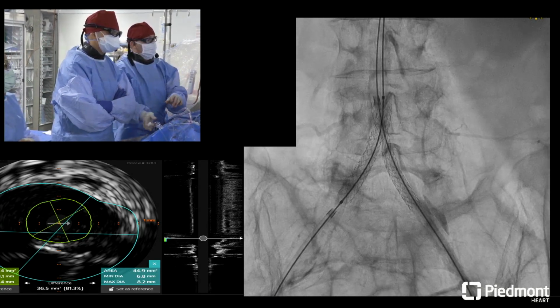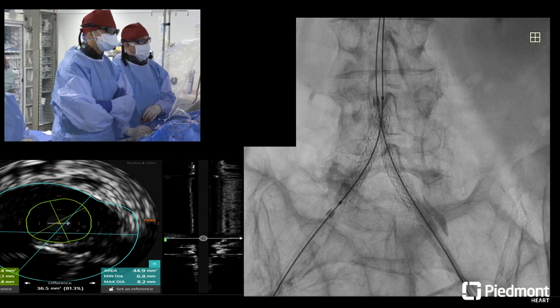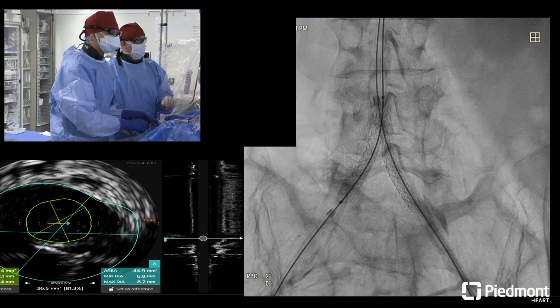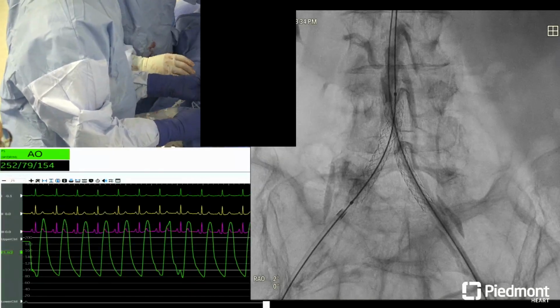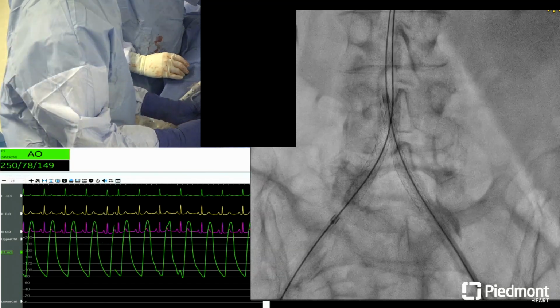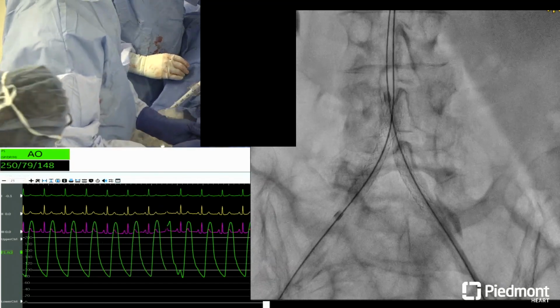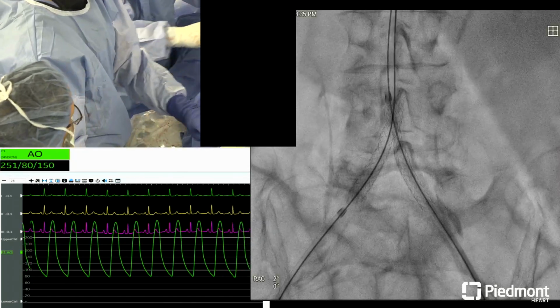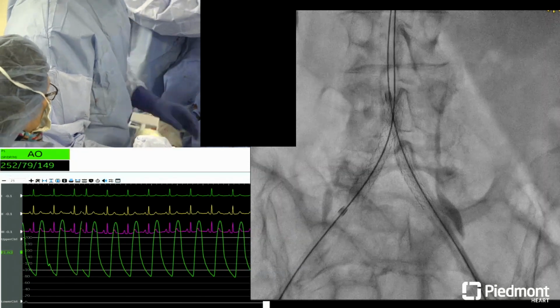So that's just outflow issues from the sheath. Yeah, and we still have the balloon on the other side, so fortunately I don't see anything blowing up in the aorta. If you guys do, let's take this out too. I think we can start post-dilating this, and then maybe that'll be a more useful picture once this is out. Or just pull negative on the sheath while you're injecting it.